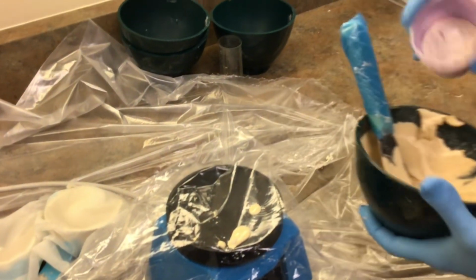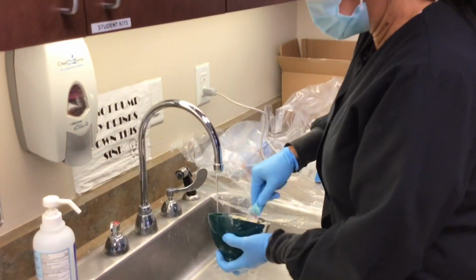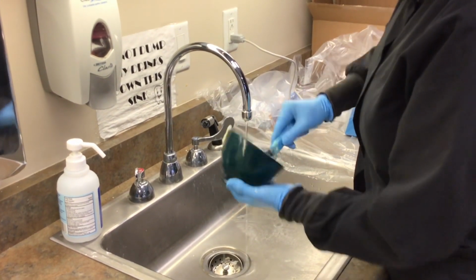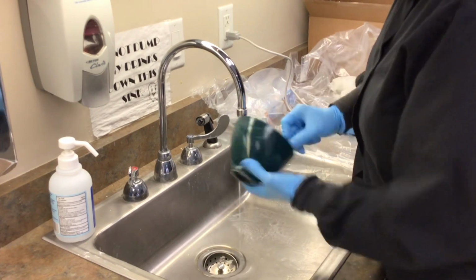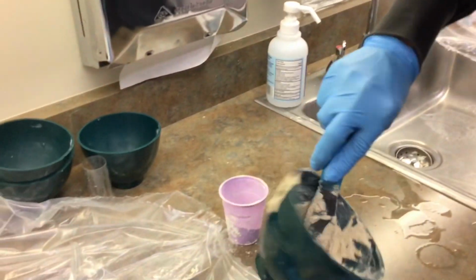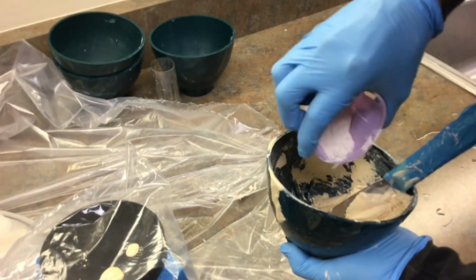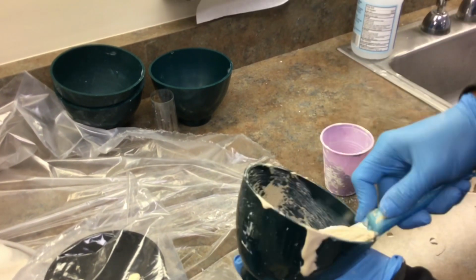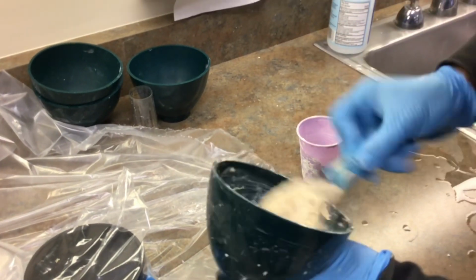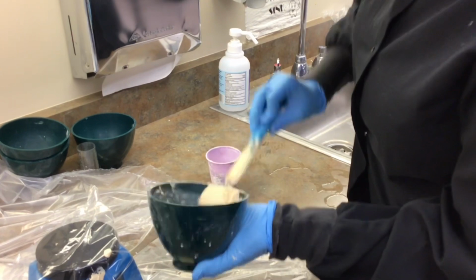Now I'm gonna go back, add more, and make it a little bit thicker. It's a little bit thicker, but I'm gonna add a little bit more because I want it thicker. The reason I want it thick is when you put a base on it, you don't want the base to be runny and turn into a pancake. So you want it to be thick enough that it won't be a pancake.